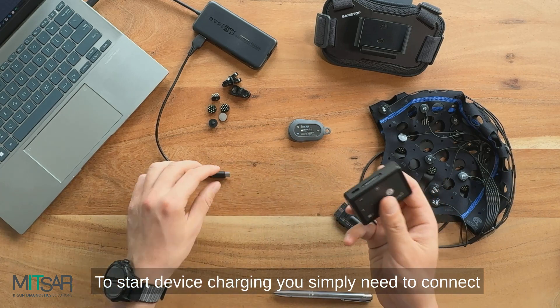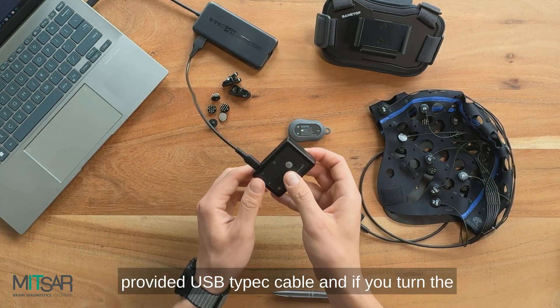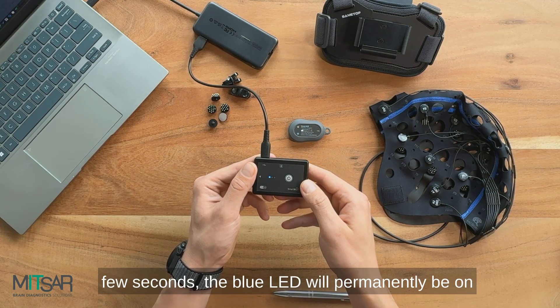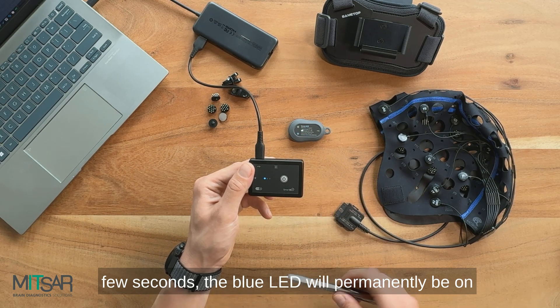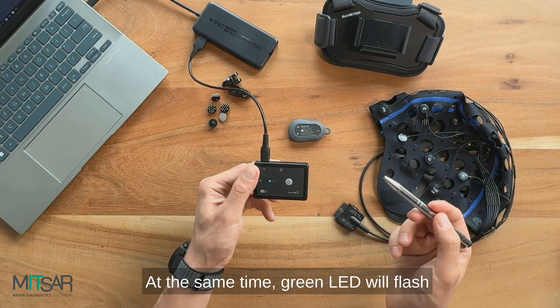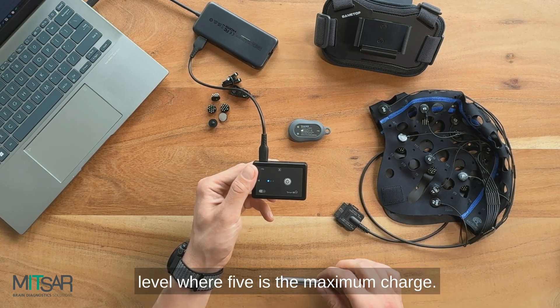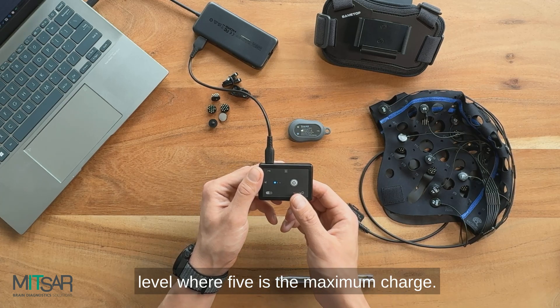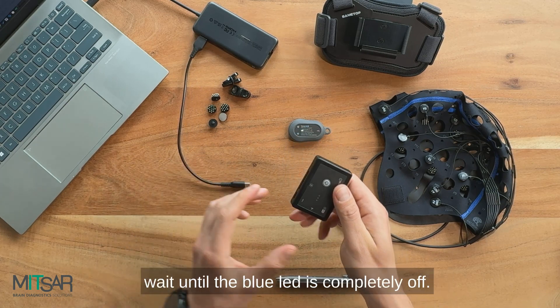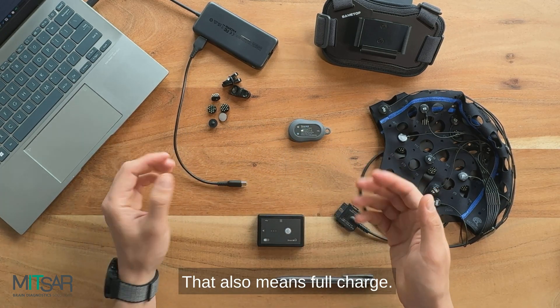To start device charging you simply need to connect the provided USB Type-C cable, and if you turn the device on by pressing the power button, for a few seconds the blue LED will permanently be on, showing that the device has been charged. At the same time the green LED will flash from 1 to 5 times showing battery charge level, where 5 is the maximum charge. Simply unplug the cable to stop charging, or wait until the blue LED is completely off — that also means full charge.